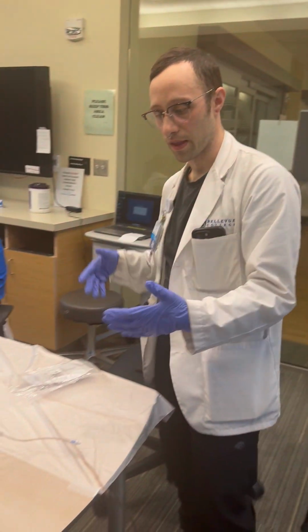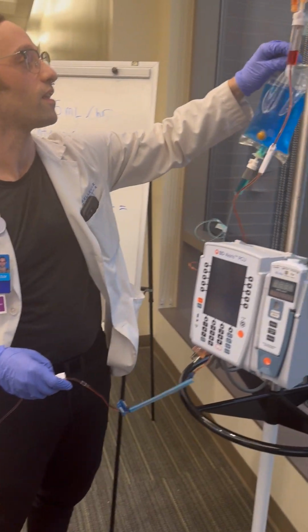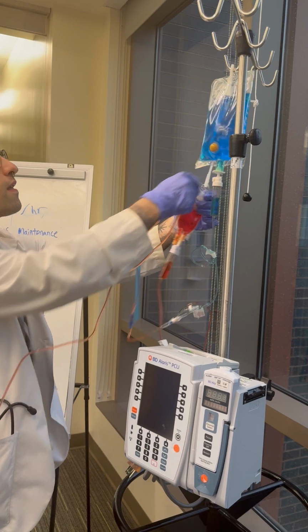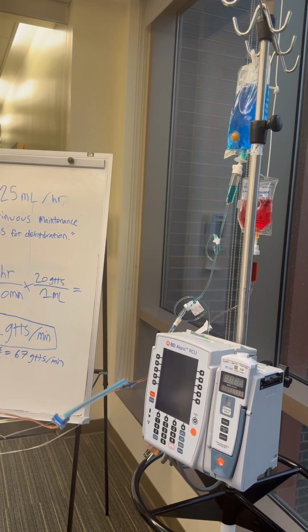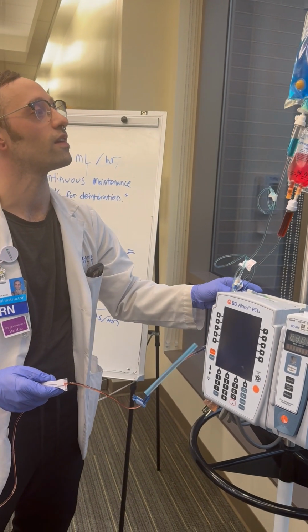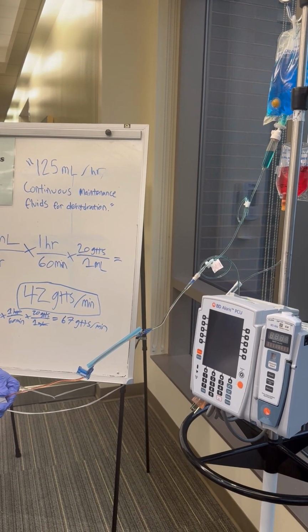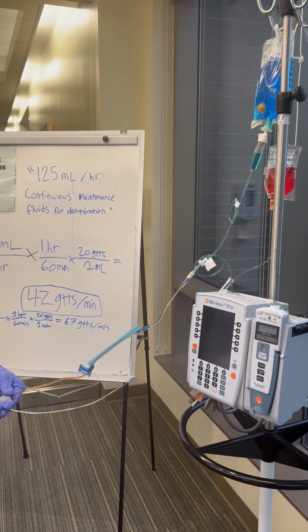So let's say time lapsed, and now this is completely done. We'll go ahead, put it back to the other configuration here. And we'll slow that way the heck down. Oh, I see what's happening. It's going into the other bag. Whoops. Yeah. And we'll put this back to the original rate, which was just about there.